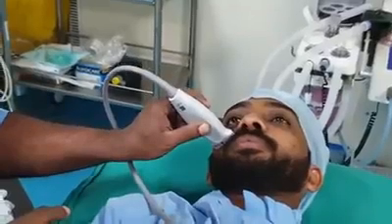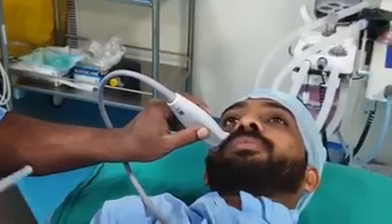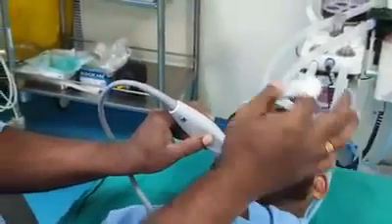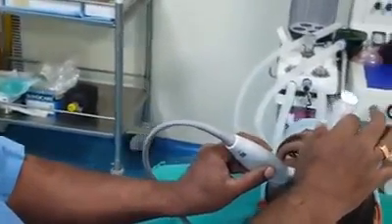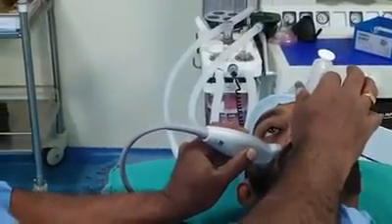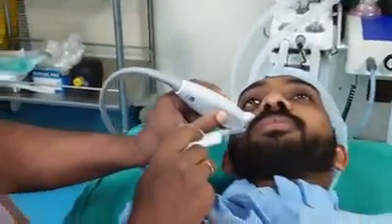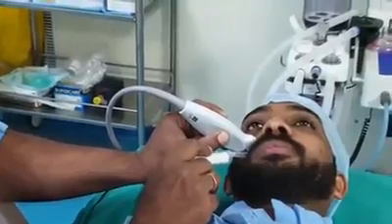Then I will be tilting my probe cranially, so that the waves pass under the zygomatic arch, and my needle will be coming from the medial side. For a better vision, I will be lifting the probe from the medial end. It's also called the lift-off technique. And for the out of plane technique, from the inferior side, I will be coming in this way.